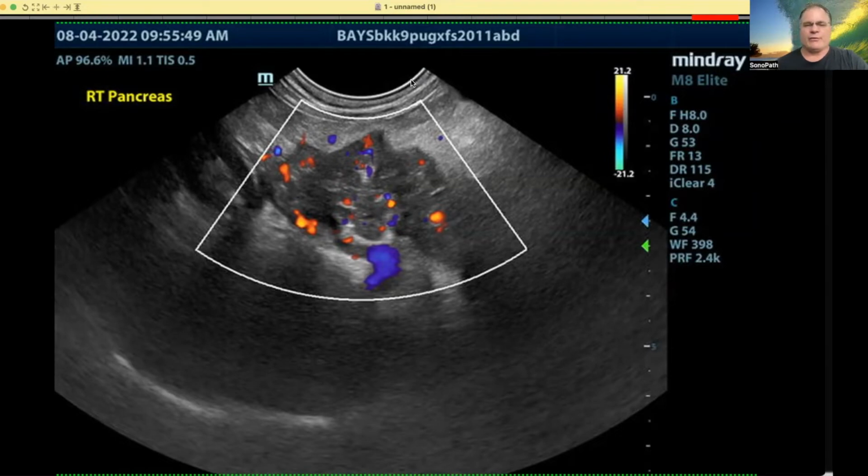This is the first installment of a new series, linguistics and a quick interpretation of sonographic pathology. Just a little insight into our world as telemedicine specialists or clinical sonographers. Just wanted to show you what we see and how we see it. We're going to start with this really interesting case.